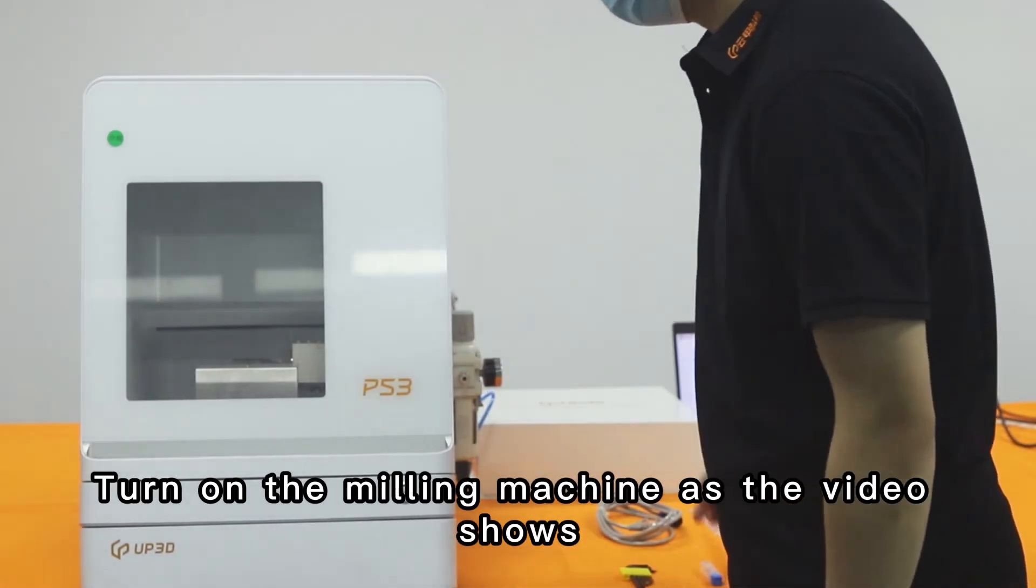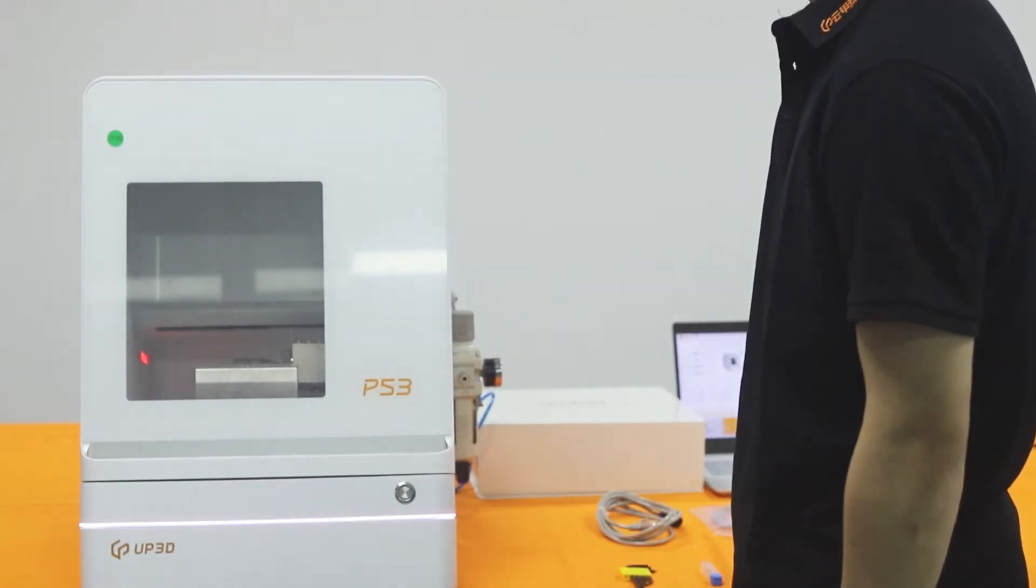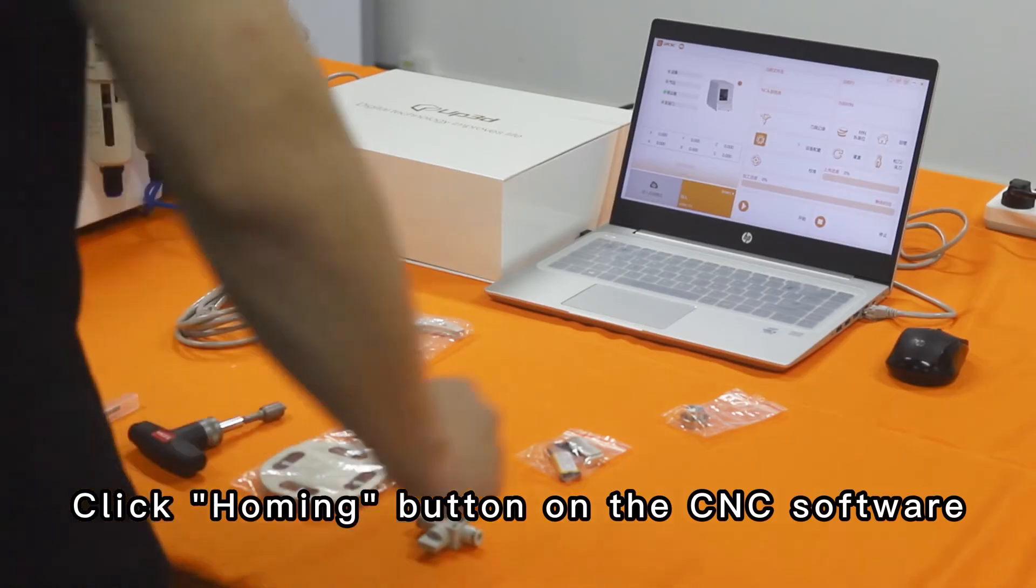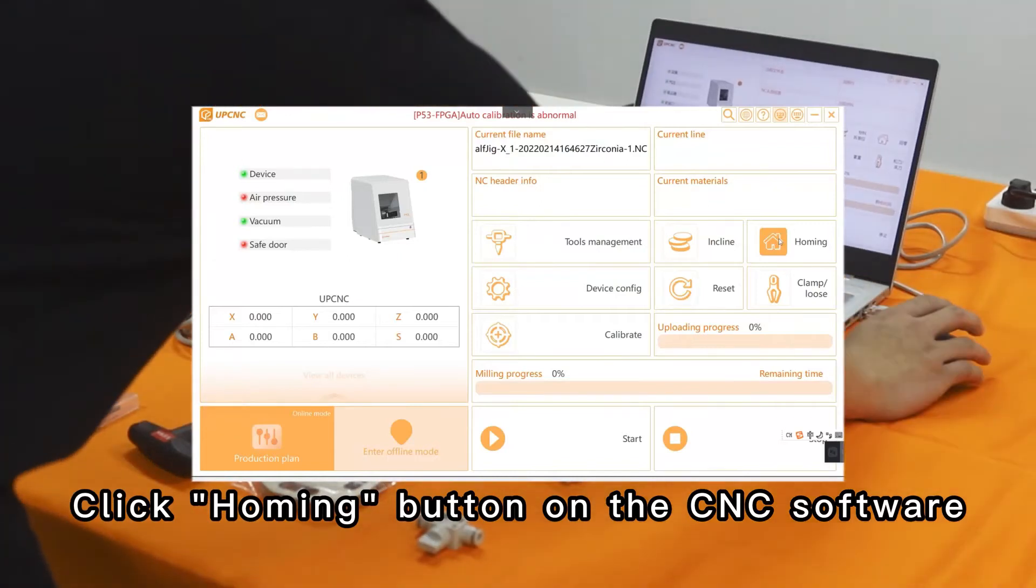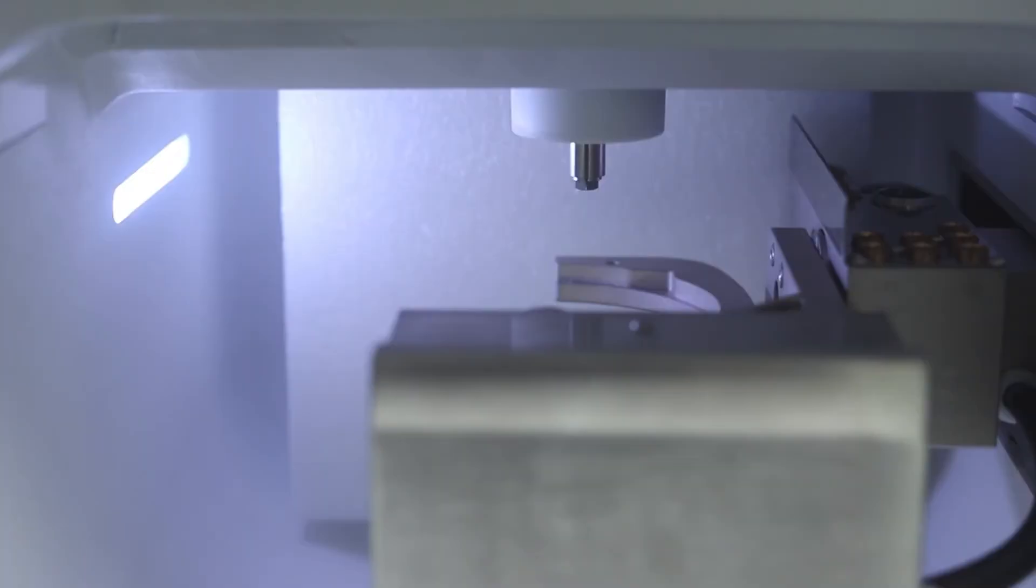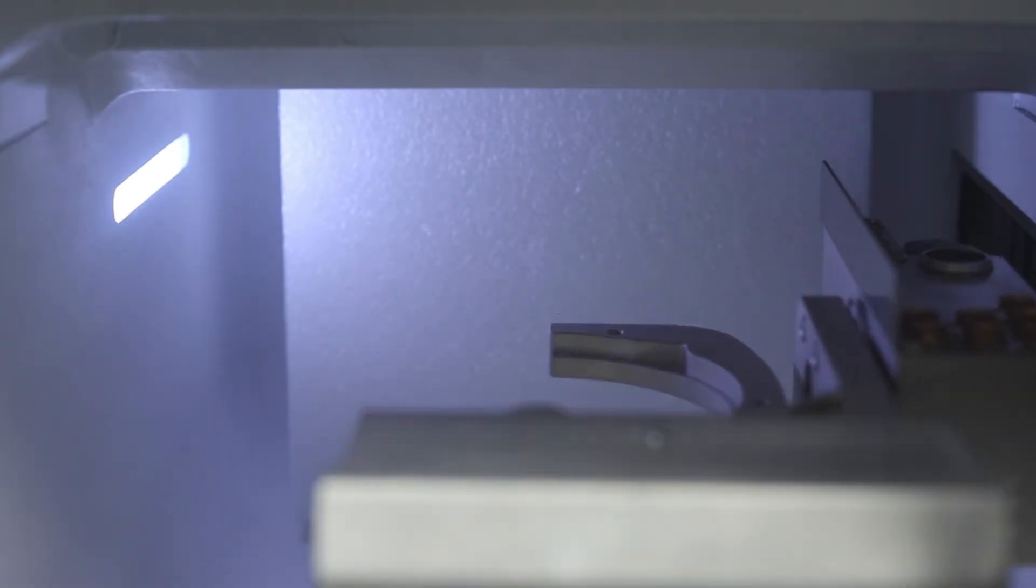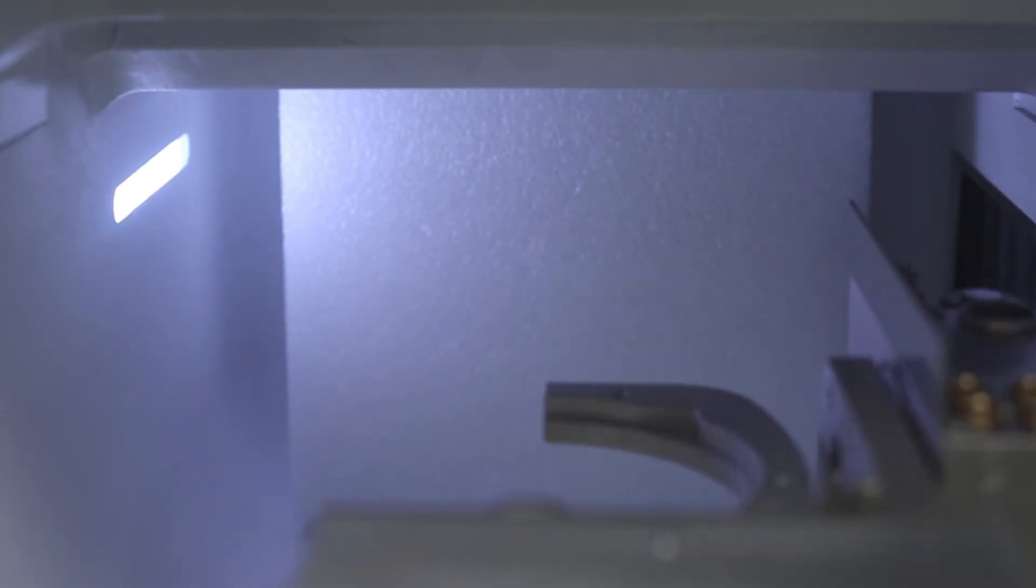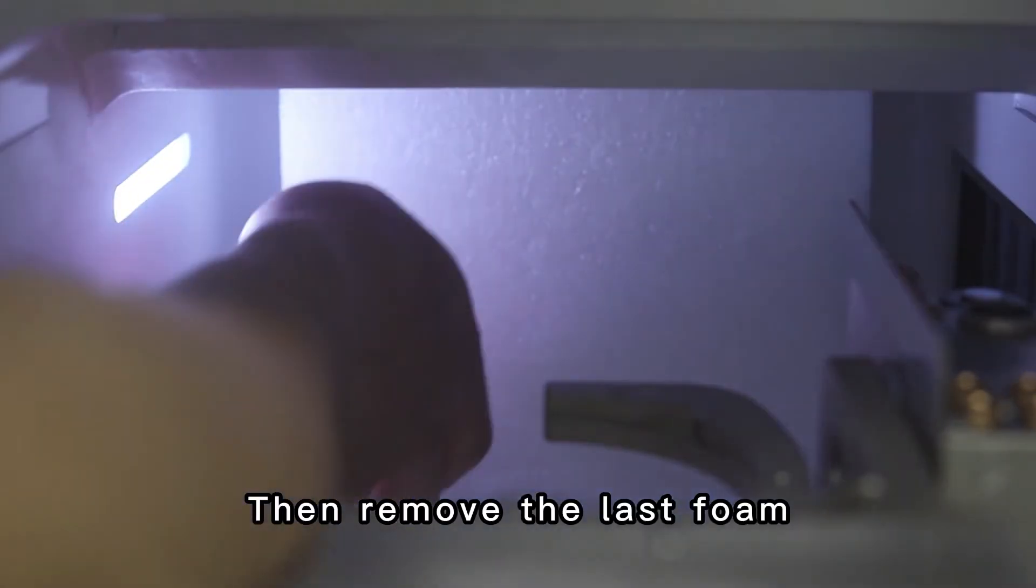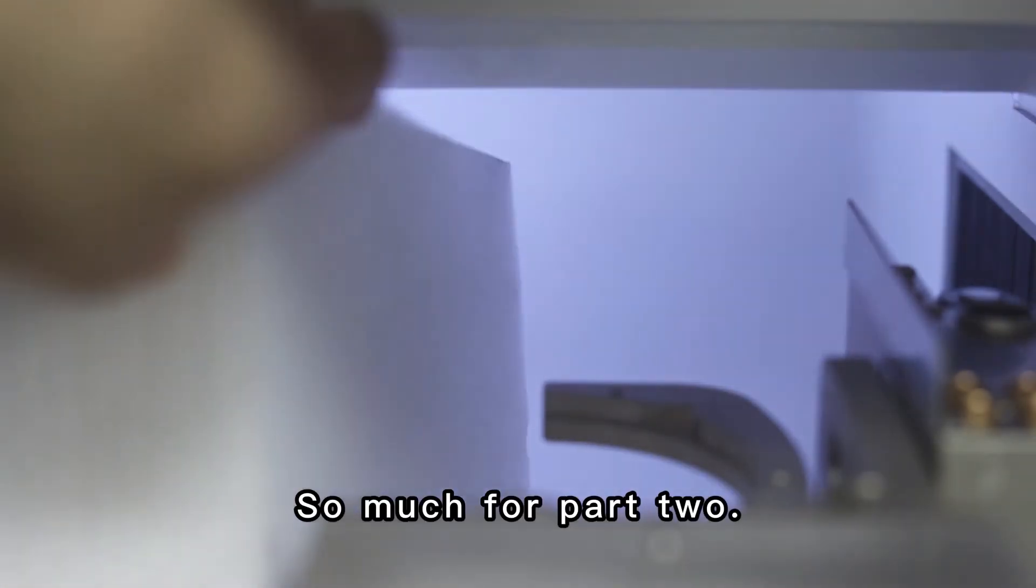Switch on the milling machine as the video shows. Click homing button on the CNC software. Then remove the last foam. So much for part 2.